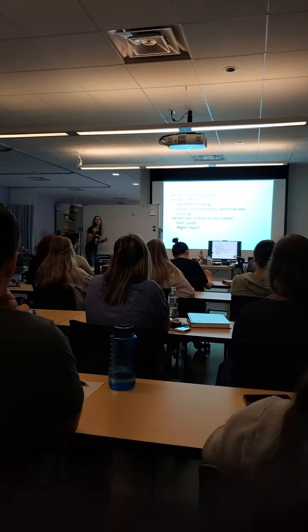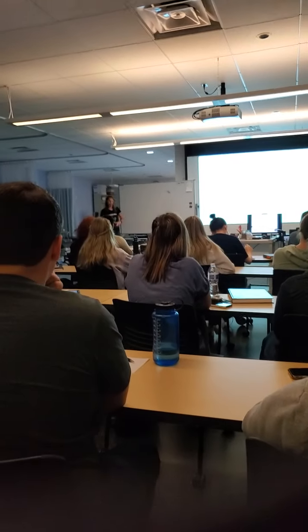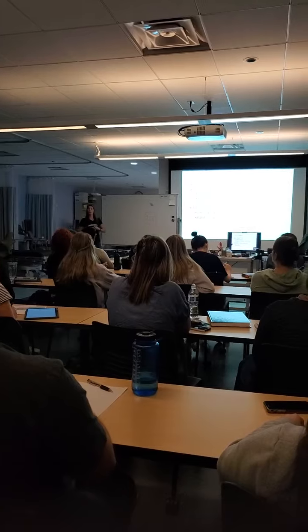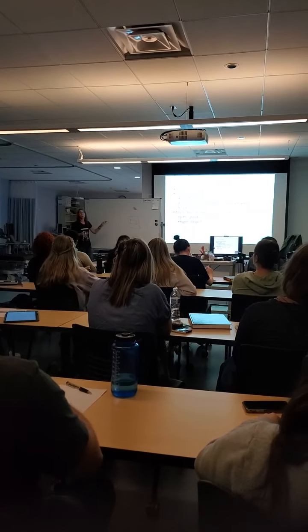And we kind of talked about our sag versus transverse. So here's my ultrasound screen. Here's my little image right here. Here's my little home button. And that corresponds to the notch on my transducer. Remember how if it was up here, I have a superior, inferior. If I'm in transverse, it's gonna be right and left, depending on. And then the AP will stay the same.